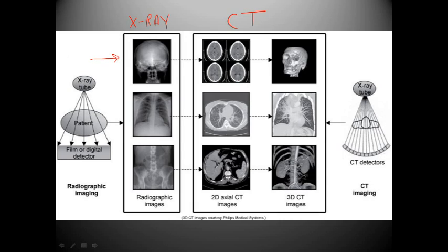most of the maxillary and the mandible, we see that we get pretty much a static image where we can possibly manipulate the window and contrast levels, but what information is on the image is what is always going to be. And so you can lighten and darken to bring out certain points of the anatomy, but still you're limited. Also notice that you cannot see the brain inside of this area.